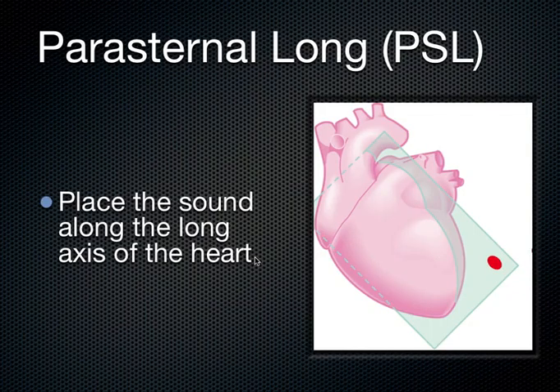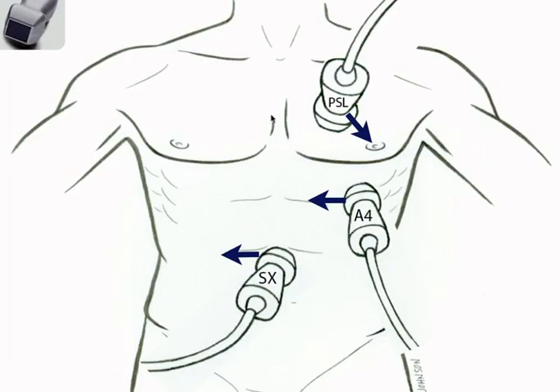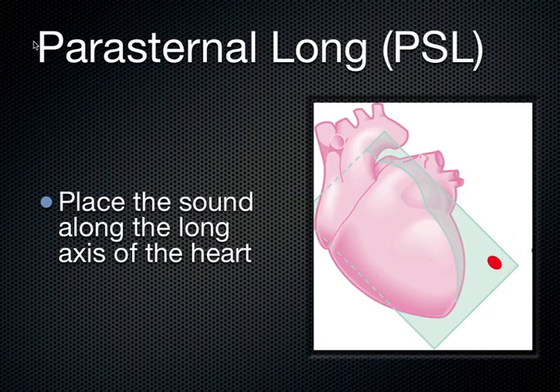To go through these in a little more detail, the parasternal long axis, as its name suggests, parasternum, you've got the probe right next to the sternum. So if the sternum is right here, you've got the probe. I actually put the probe on the sternum and then just slide it off a little bit, aiming the indicator toward the patient's left if I'm doing the parasternal long. And this is what the transducer looks like that we use. It's the P21 or phased array, small footprint, 21 millimeters of footprint there right along the parasternal region.